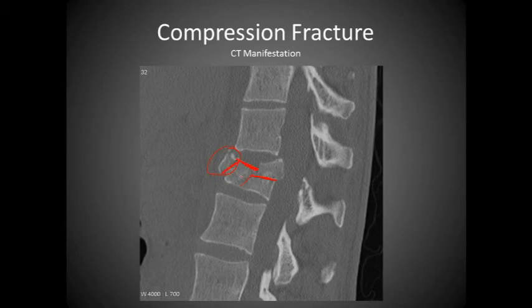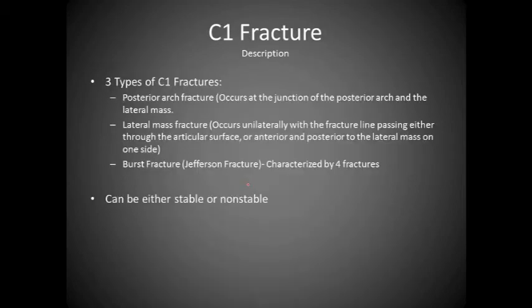One thing to kind of distinguish a compression fracture versus a burst fracture is that usually the vertebrae look compressed, kind of shrunken in size, and also the fact that we have horizontal fractures, whereas on the burst fracture we saw just simply vertical fractures. But we do see that the spinal canal does have some impingement here due to this posterior bone.